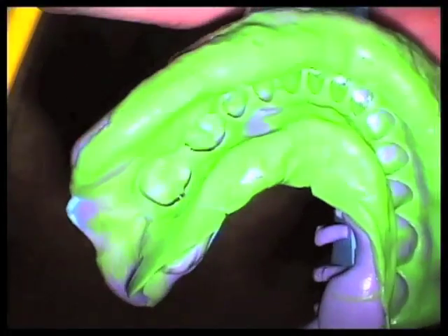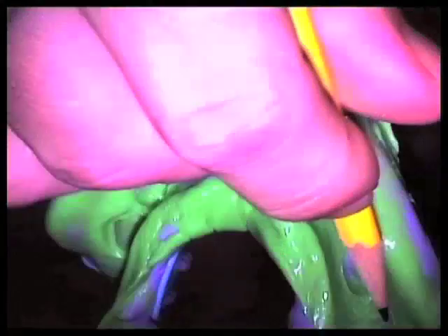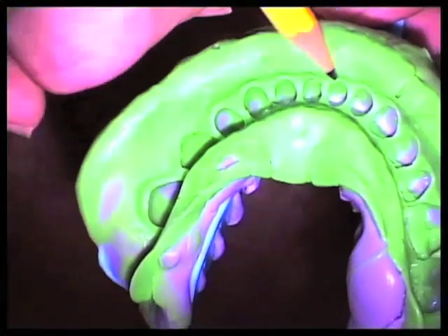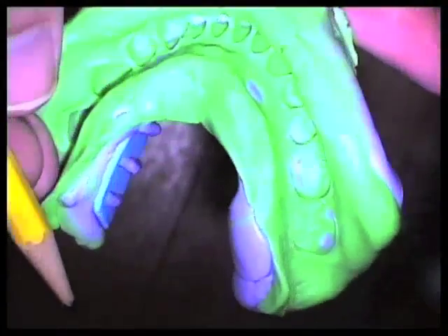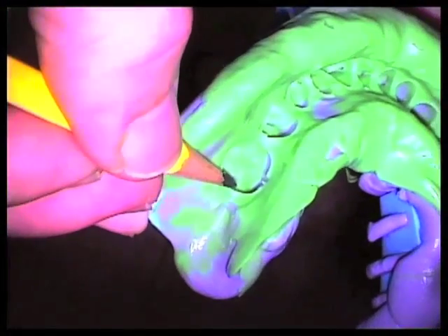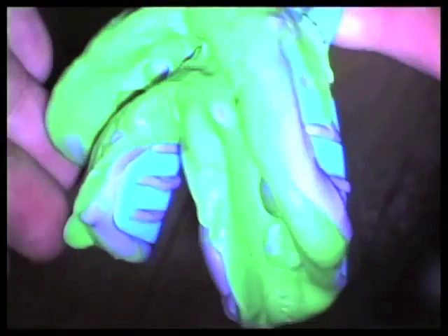You look at the mandibular model, and it's the same thing. We want to make sure that we've got free gingival margin buccally, we've got free gingival margin lingually, we've got land areas on the buccal, we've got land areas on the lingual, and we're well extended past the most distal molar, and we've even captured the retromolar pads back here.